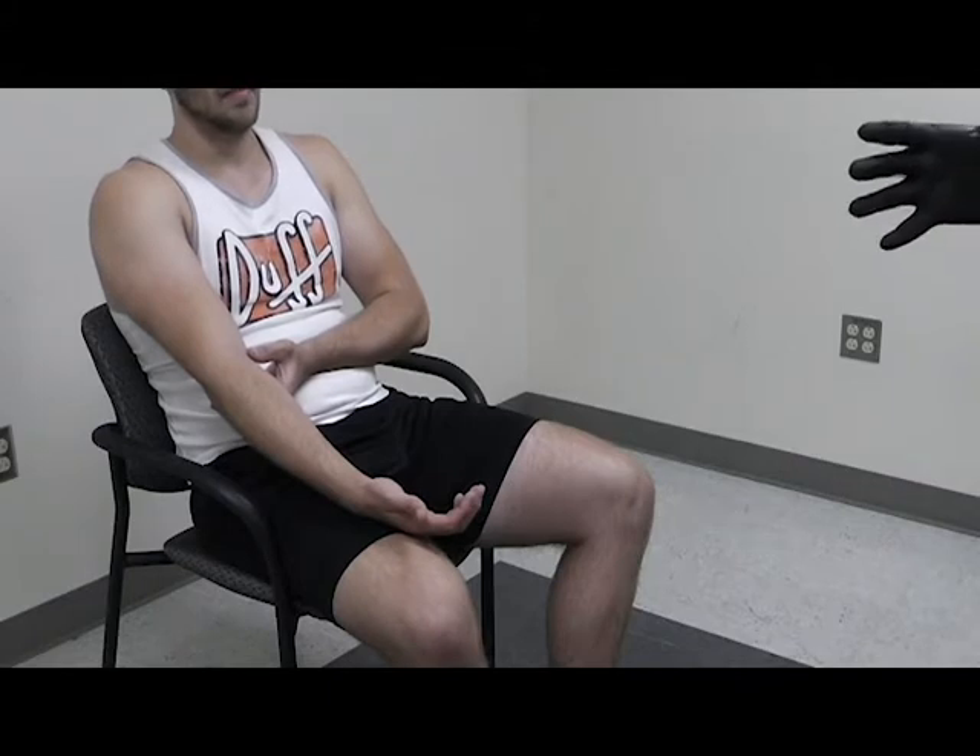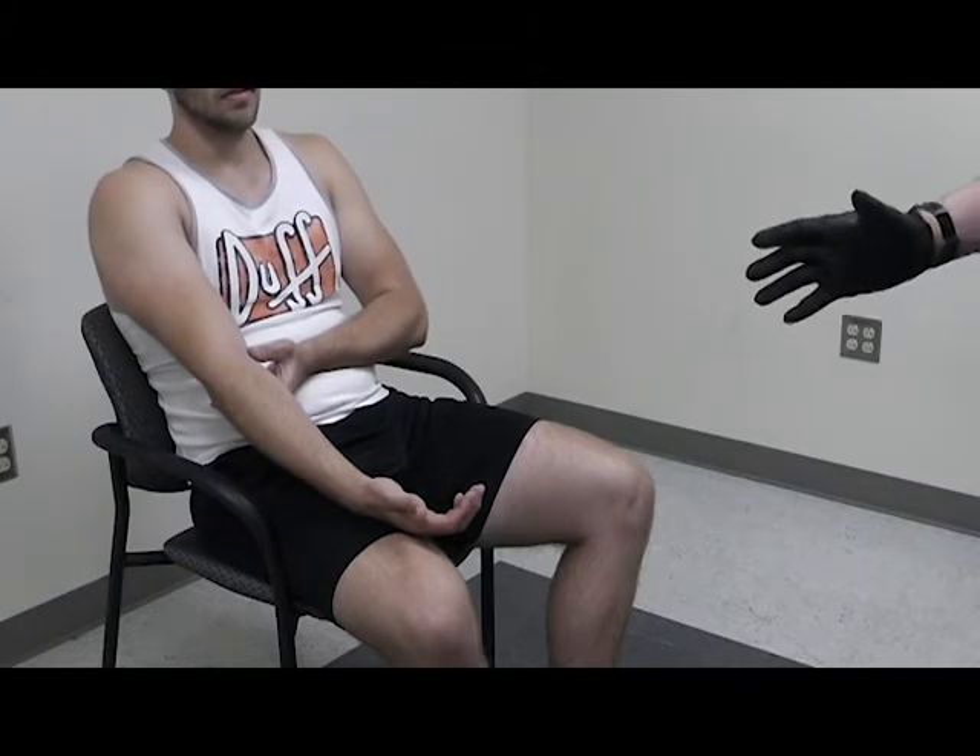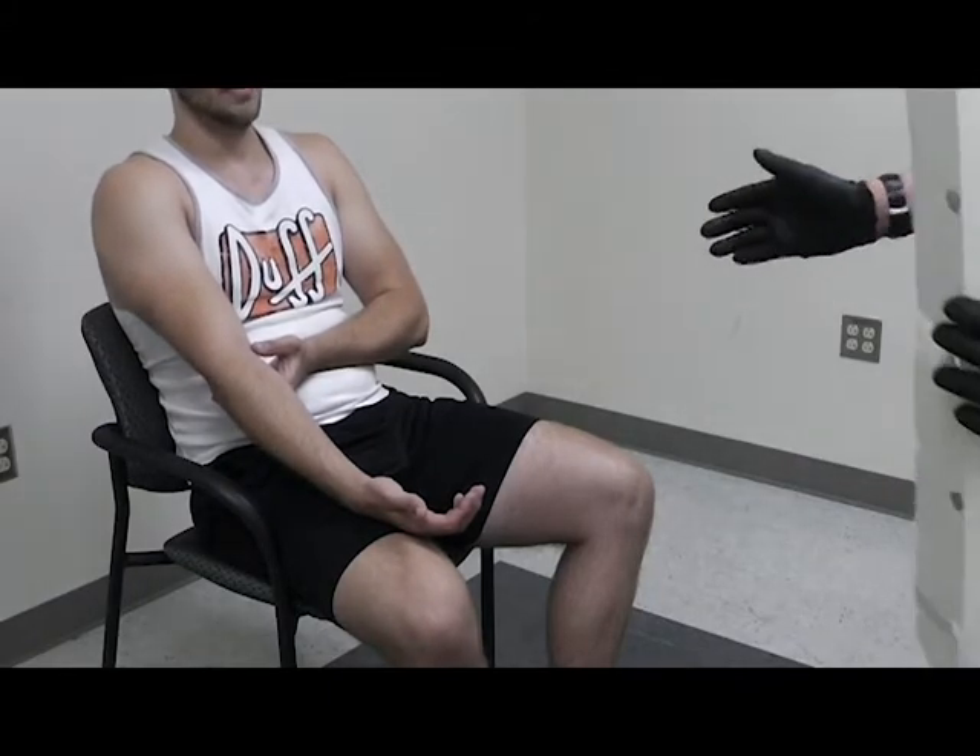This is a demonstration of joint immobilization. I want to ensure that I have my PPE and BSI on, and I'm going to instruct my partner to take manual stabilization of the joint.